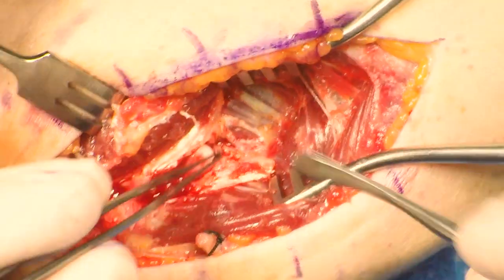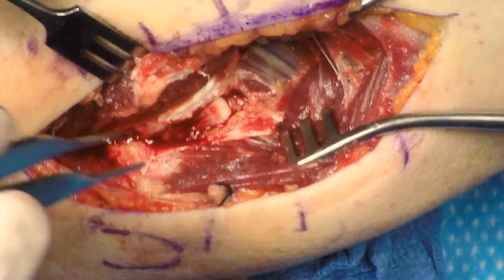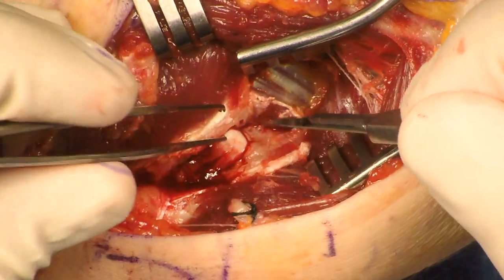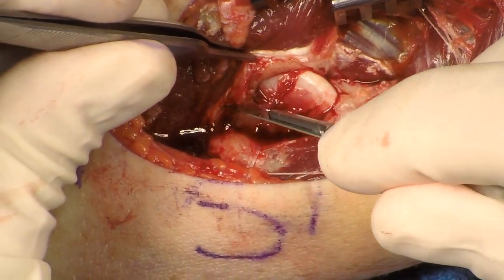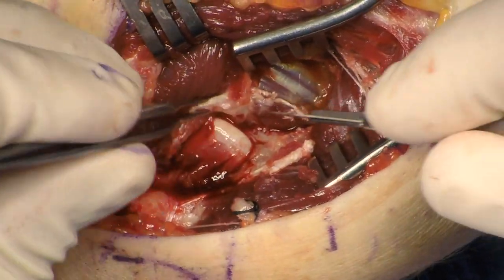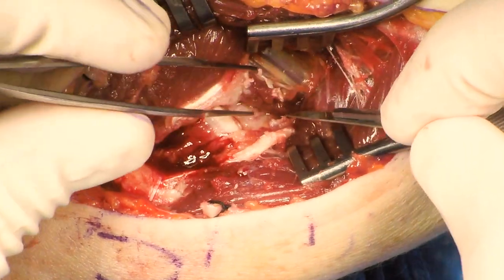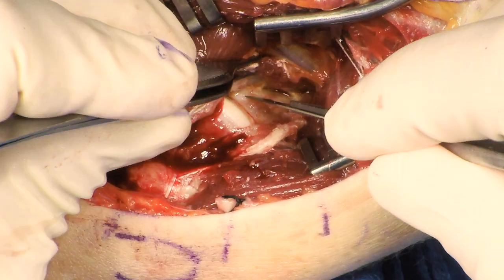The retractor is continually repositioned. The brachialis can be visualized coming in and inserting just distal to the coronoid. A portion of the brachialis can be elevated. The coronoid is then visualized. The anterior capsule is released a little bit and the dissection is taken subperiosteally on the coronoid, elevating a little bit of the brachialis.